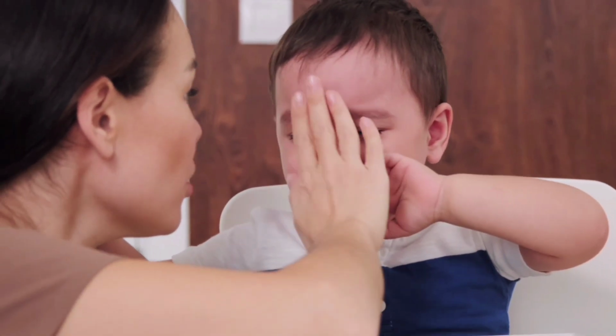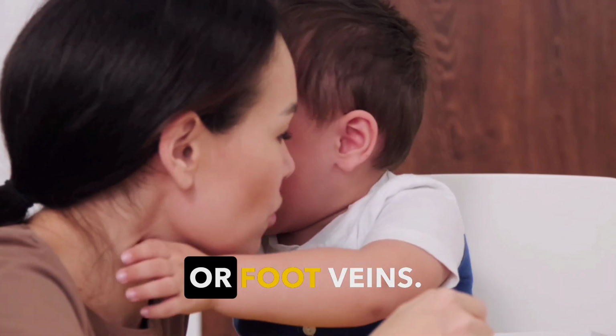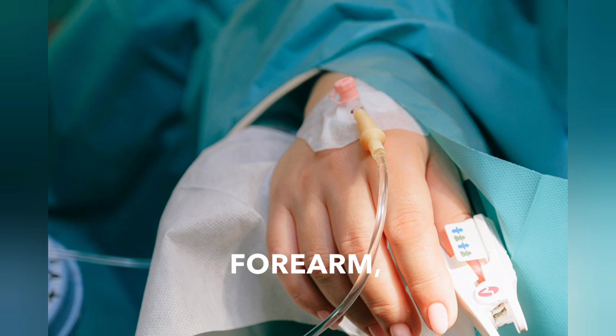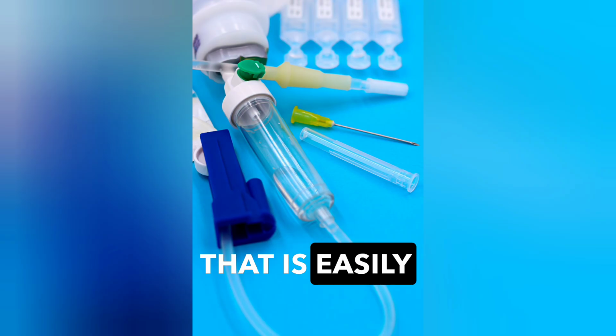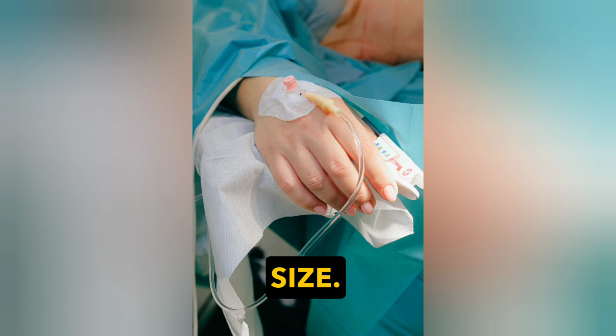2. Physical preparation. Site selection. Newborns and infants: scalp, dorsal hand, or foot veins. Older children: dorsal hand, forearm, or antecubital veins. Choose a vein that is easily palpable or visible, straight, and large enough for the cannula size.